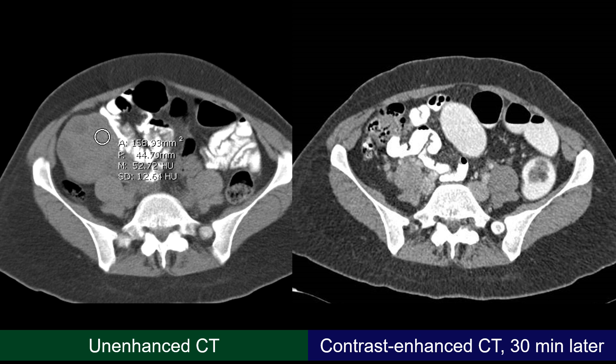With such an attenuation value of 52 HU, we need to think of iodine, iron, or calcium. Calcium is out because usually it is denser and more spotty, and we have just seen a spot of calcification within the same lesion. So the background of the lesion is rather dense, probably because of iodine or iron content.